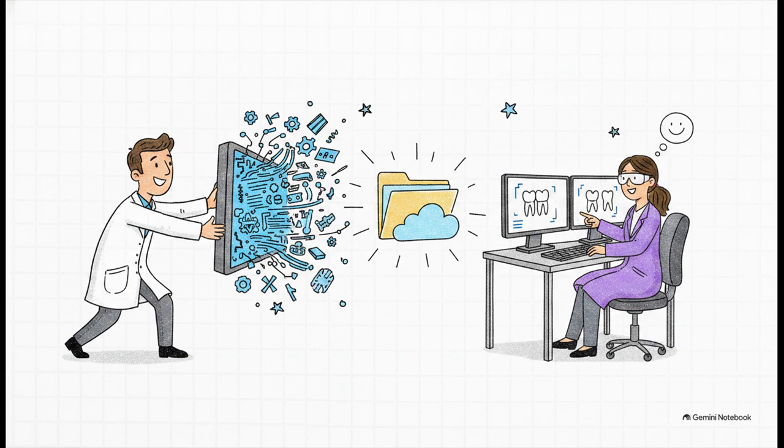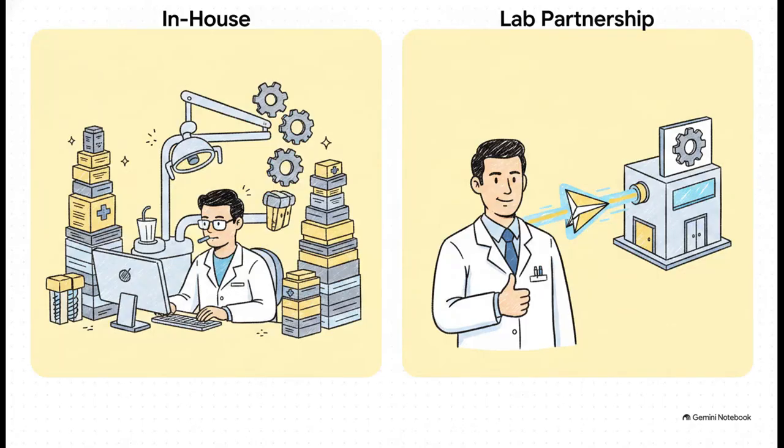You can breathe a huge sigh of relief right now. Dentists do not have to become software engineers to safely practice guided surgery. You can entirely rely on a specialized guide laboratory to do the heavy lifting for you. You just submit your imaging and case information, and the lab uses its advanced software and expertise to produce the final guide. And this brilliantly illustrates the 2 primary business models.